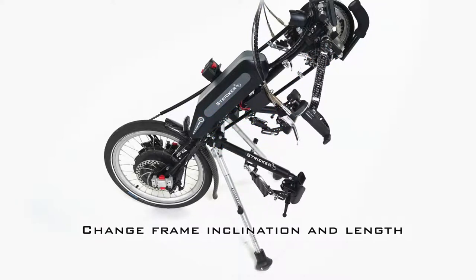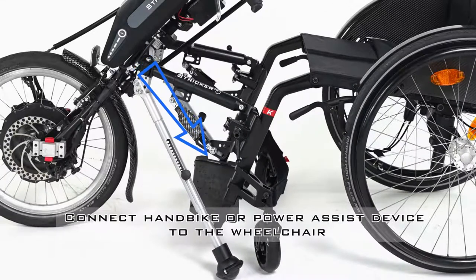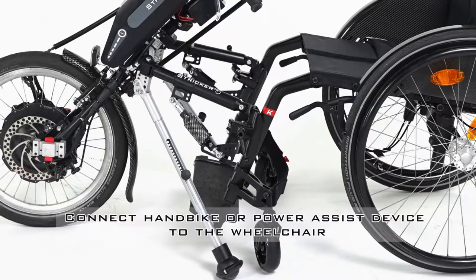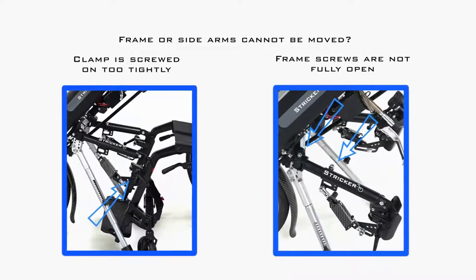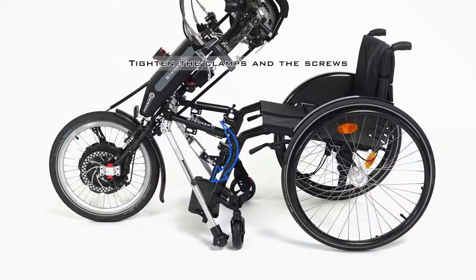Now you can fix the handbike or power assist device to the wheelchair. Open the automatic catch to be able to tilt the clamp. Loosely fix the clamps to the wheelchair and now straighten the frame. If the frame or the side arms cannot be moved, either the first clamp is screwed on too tightly or the frame screws are not fully open. When the frame is aligned, tighten the clamps and the screws.